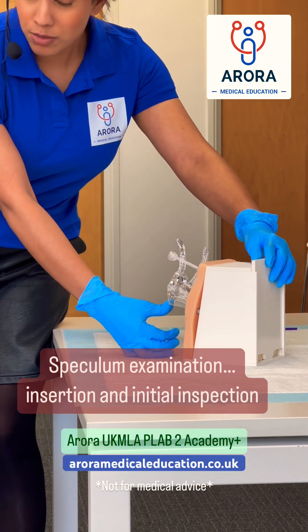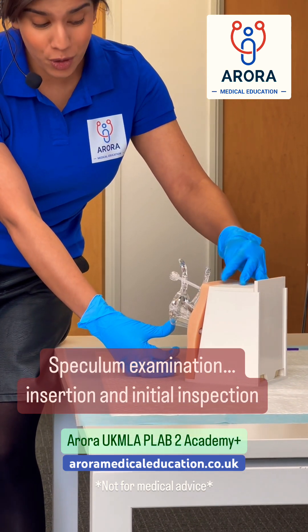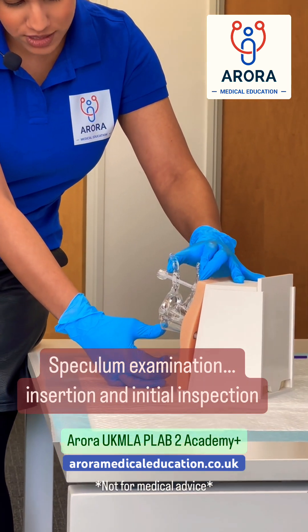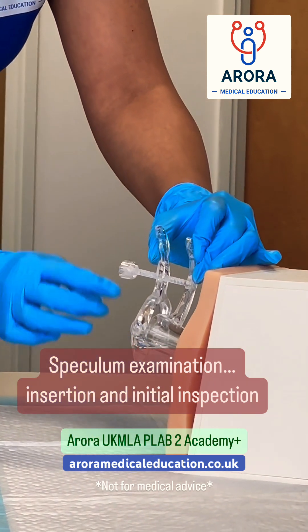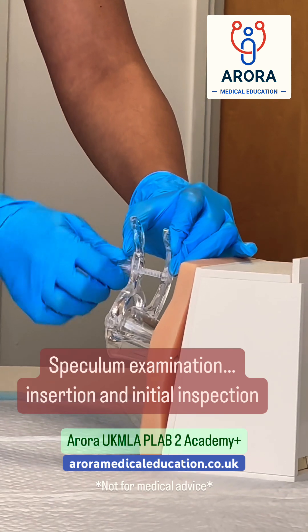At this point, tell the patient if they want to know that. Some patients don't want to know that you're opening the speculum. And now gently press the two levers together and then with your dominant hand, screw the bolt shut.